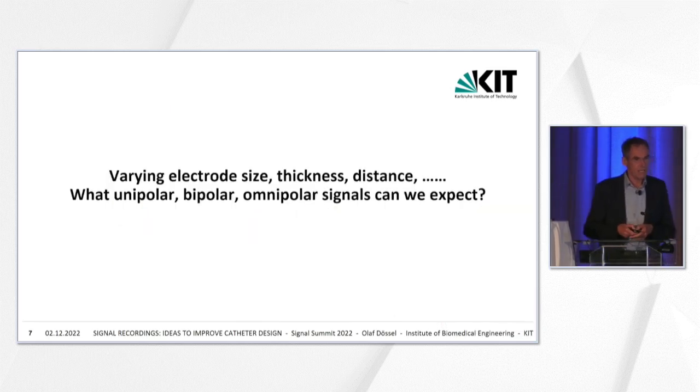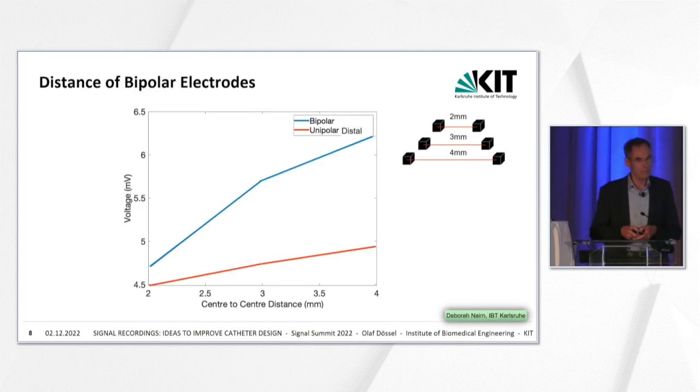Varying electrode size, thickness, and distance. This is something that I showed to you last year already, so I will be very brief. We changed the center-to-center distance of bipolar electrodes.